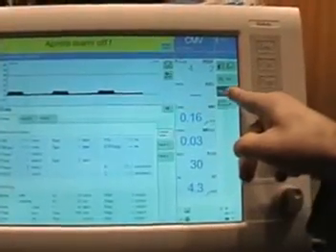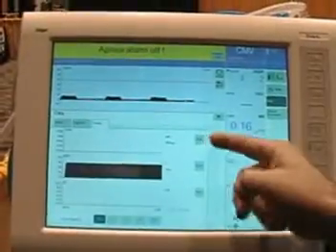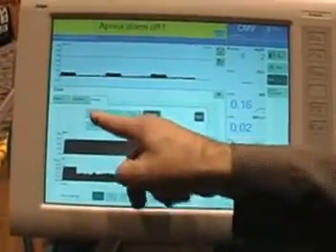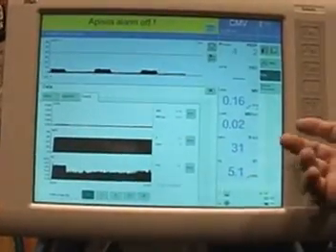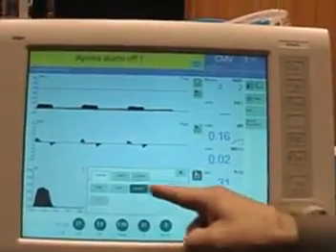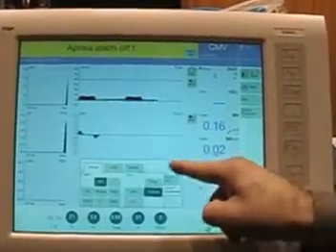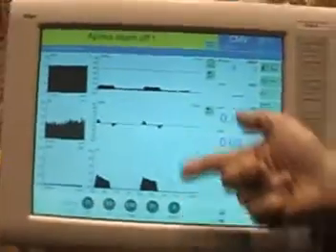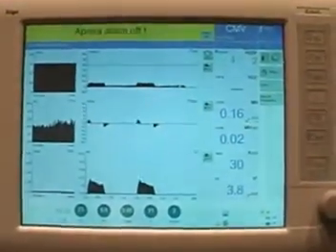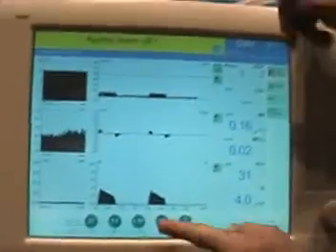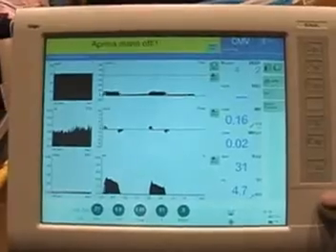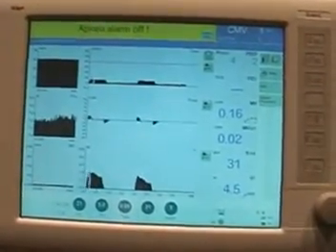From a trending standpoint, you can pick from a list of whatever trends you want — for example, minute ventilation tracked for up to 24 hours. You can also go to the main screen and view curves and trends together simultaneously: pressure, flow, and volumes displayed alongside trending parameters such as frequency, exhaled tidal volume, and minute ventilation. The user has 100% access to what they see and where they want to see it — far better than the small screen on the original Evita 2.